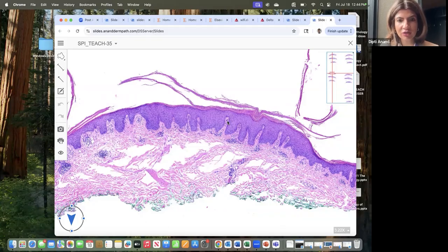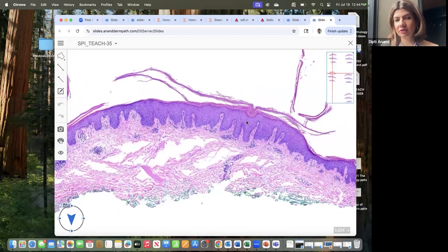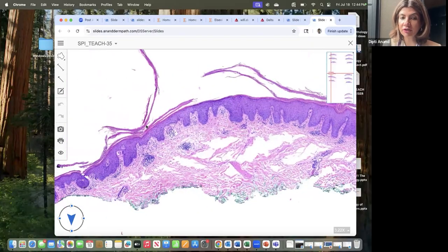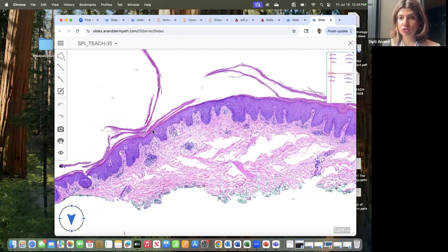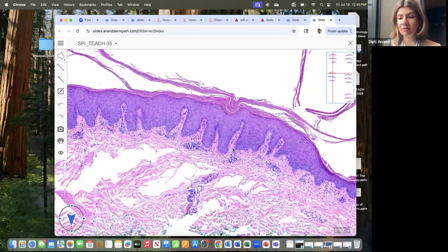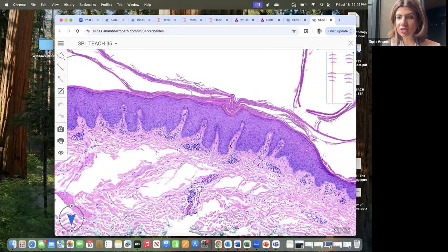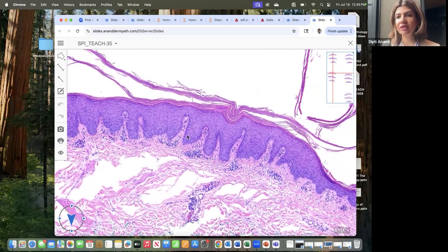The first thing which I look at is that the psoriasiform pattern is not that prominent. So you have actually a very thick cornified layer, which is out of proportion to the thickness of the epidermis. So the epidermis is thick, but the cornified layer is thicker out of proportion. Okay. And you have what are known as the more rounded rete ridges, so more bulbous, rounder, fat rete ridges, and less of the suprapapillary thinning than what you see in psoriasis.